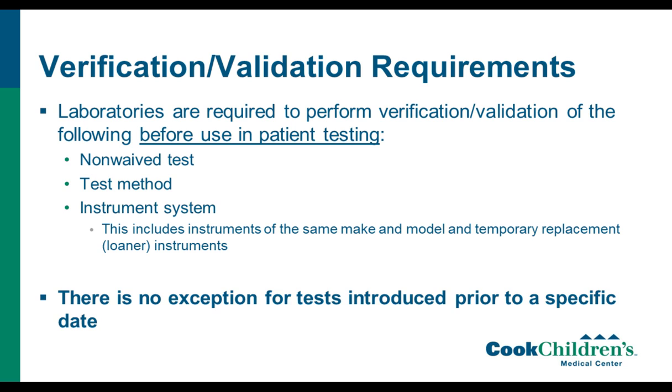So as far as what's required when it comes to verification and validation, we're going to focus on the CAP definitions. Laboratories are required to perform this initial verification or validation before the test is used in patient testing. So you can't bring it in and start testing patients and then ensure that it's performing well. And this is required for any non-waived test, a new test method, or a new instrument. So even if you run a CMV quant, if you bring in a new platform, you have to validate that.